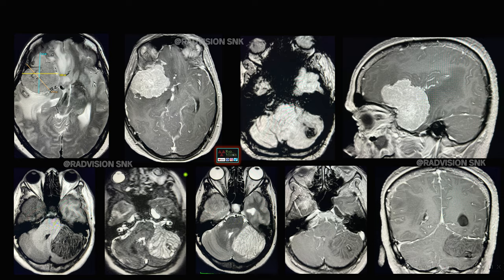The last case: there is an extraaxial iso- to hyperintense lesion noted against the right frontotemporal region with significant perilesional edema and mass effect, showing intense homogenous enhancement. Also, there is a hyperintense area in the cerebellum showing multiple abnormal folial patterns appearing as a lamellated or tigroid appearance, with blooming on GRE and no significant enhancement on IV contrast. This is a classical case of meningioma associated with Lhermitte-Duclos disease — meningioma associated with Lhermitte-Duclos disease is a rare occurrence. Thank you all.